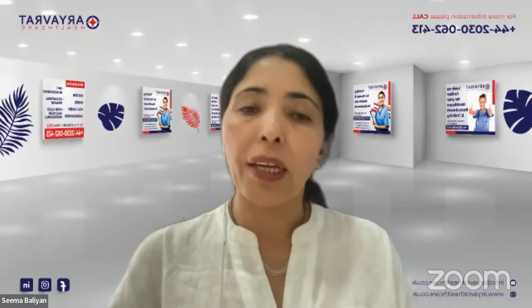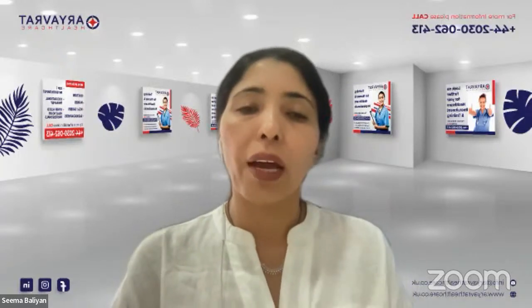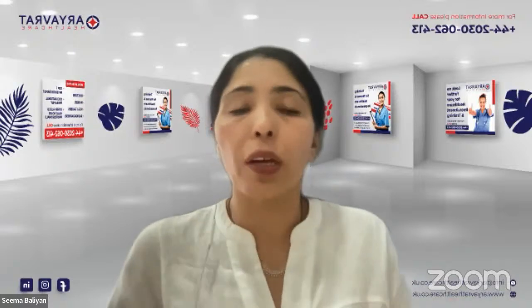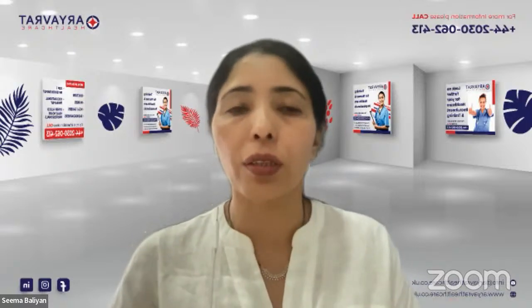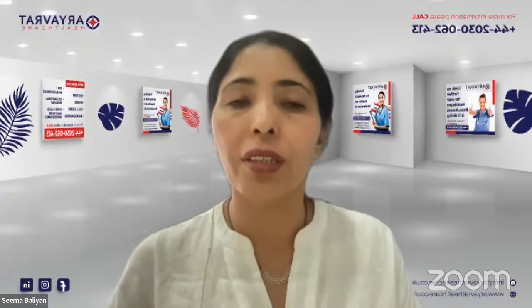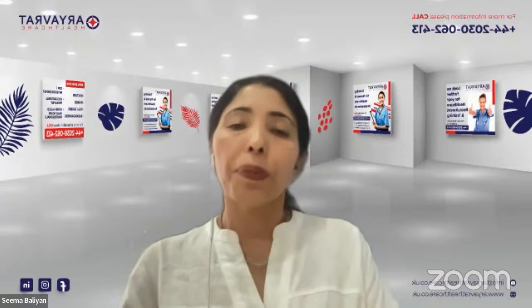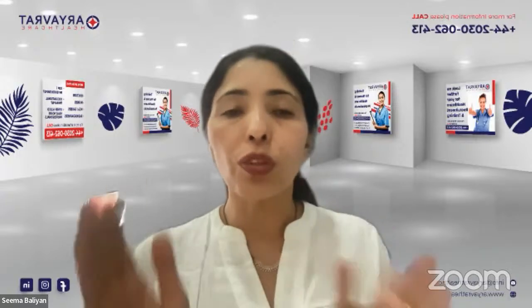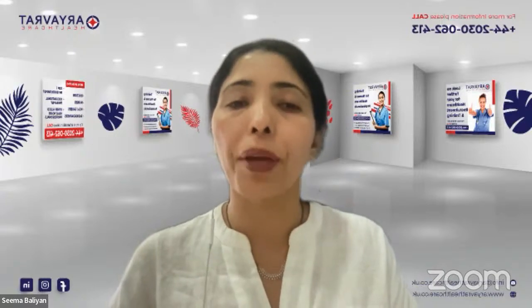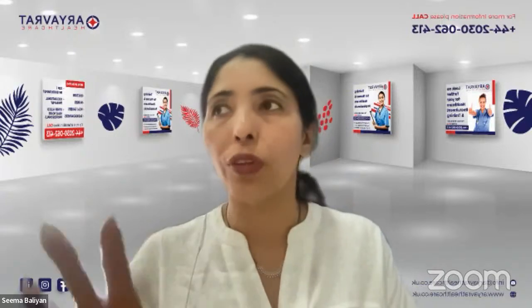Read about the inhalers and the peak flow and practice saying these things, because you do not actually require anything to do this task. So peak flow and inhaler, you can almost master it just as an online thing. So please do that so that at least your 2-3 stations are out. You do not have to practice as much when you are coming for face-to-face, and you can focus more on the others.